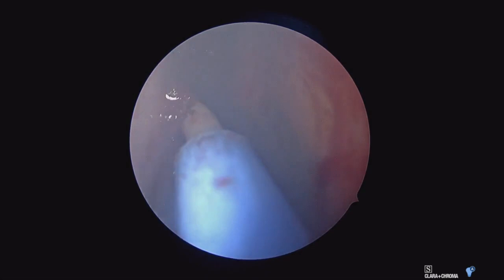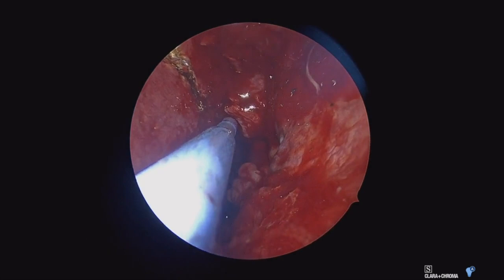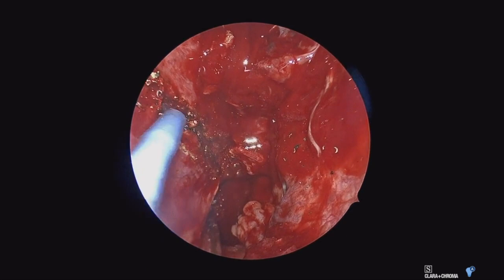I'm using a needle tip bovie cautery to incise wide margins around the nasal septal involvement. We'll sample all these areas for margins as we resect. Here we are at the posterior nasal septum making our mucosal incisions, then coming all the way through the septum on the contralateral side. There is some tumor involvement in the high superior septum on its right side as well.